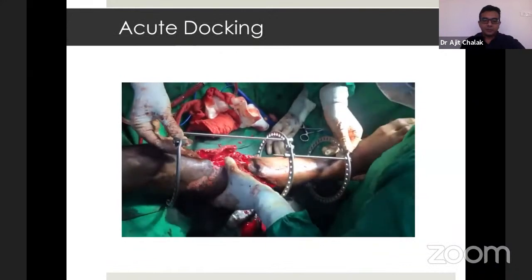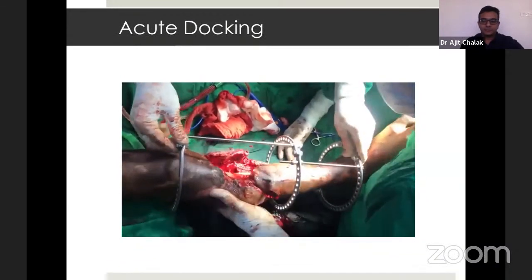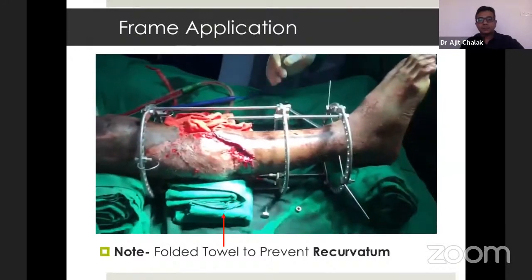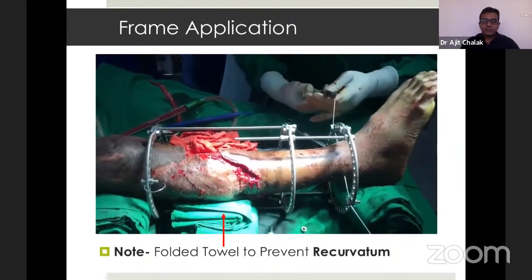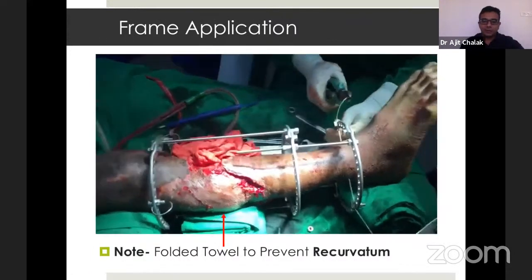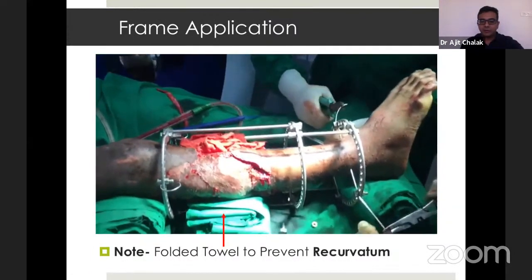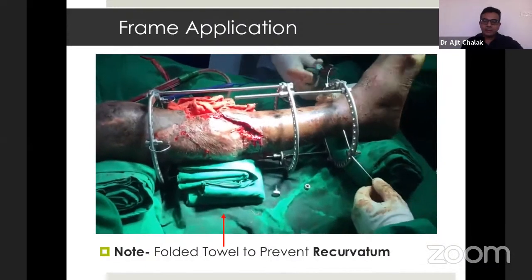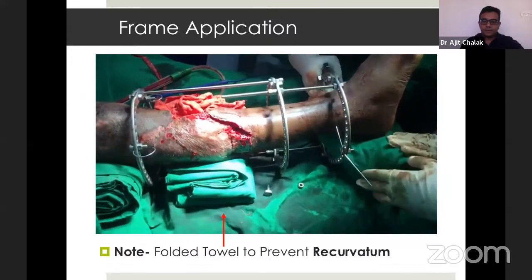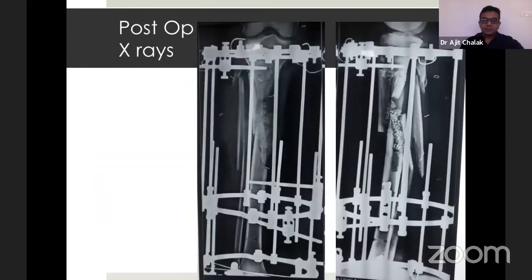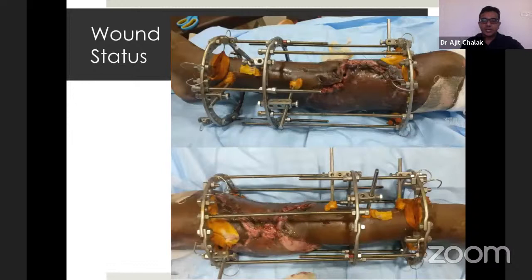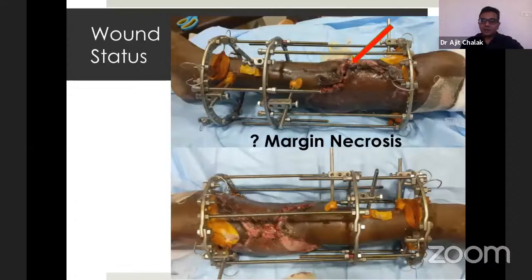This video shows the acute docking. During application of the frame, you can note a folded towel used to prevent the recurvatum deformity between the leg and the ring. These are his post-op X-rays. Despite using those towels, I ended up with a recurvatum deformity in the tibia. This is his wound status on day 2, where you can note a marginal necrosis of the skin.